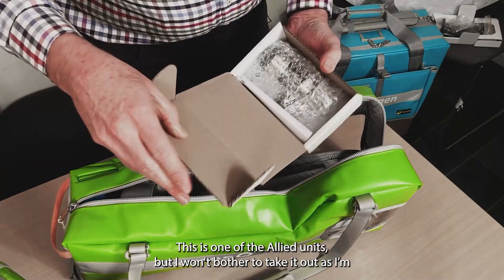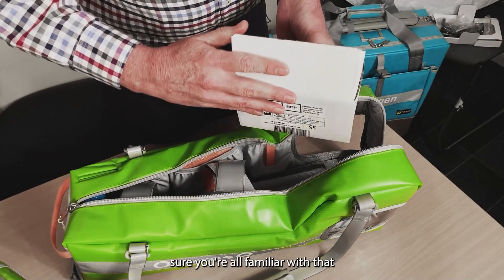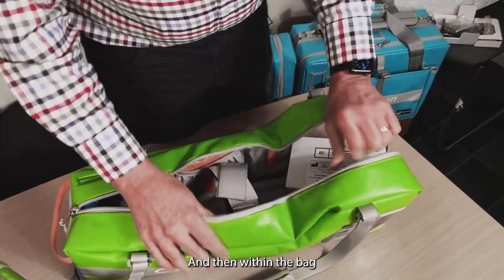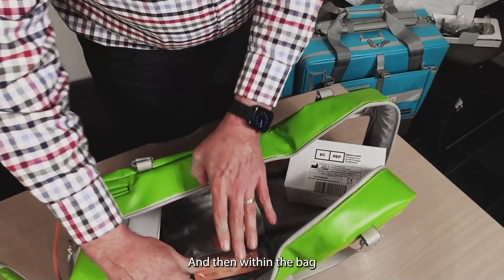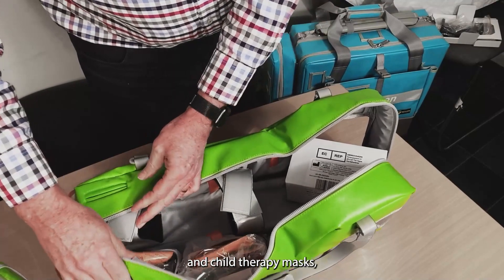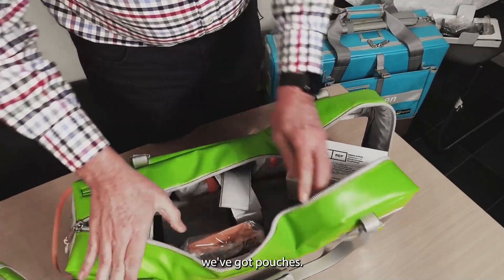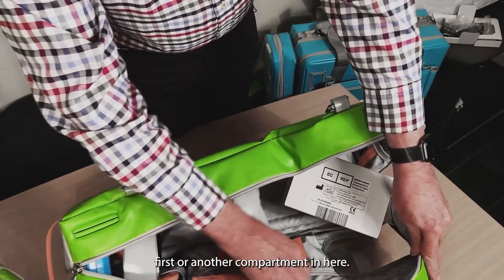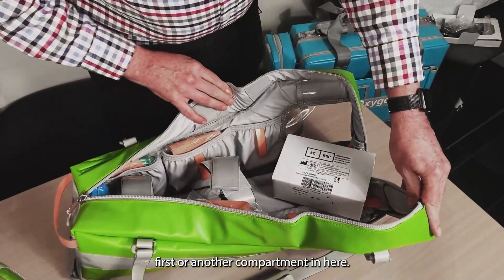This is one of the allied units, but I won't bother to take it out — you're all familiar with that, or we can cover it in a separate video. Within the bag, we've got room for the adult and child therapy masks, and there are pouches for first aid and other components.